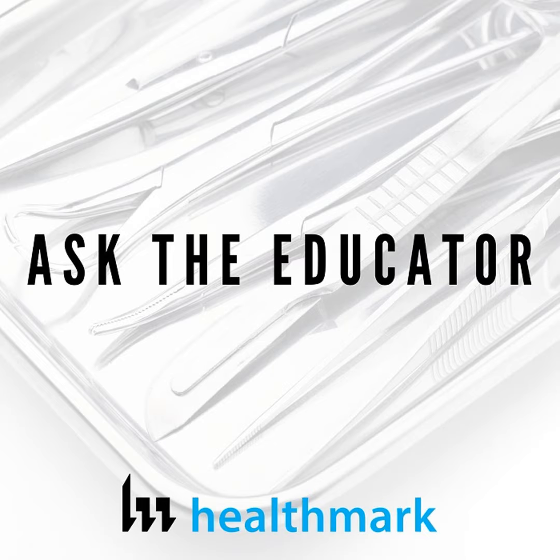And then when you look at the role of SPD, we've simplified that and said SPD has 3 primary functions. Instruments have to be available, they have to be functional, and they have to be safe for every patient use. What we find is that you have a production function: what variables go in to achieve those three primary goals? It boils down to the number of staff. This is probably the most critical factor, the number of staff you have in the department, because if you're understaffed, you're never going to get to your three goals of available, functional, and safe to use. And then it is the proficiency of the staff.